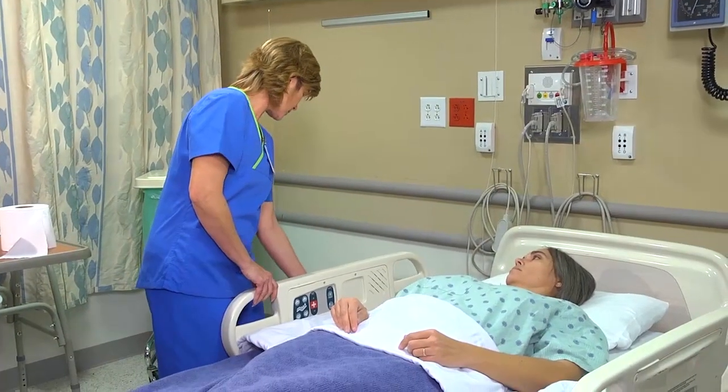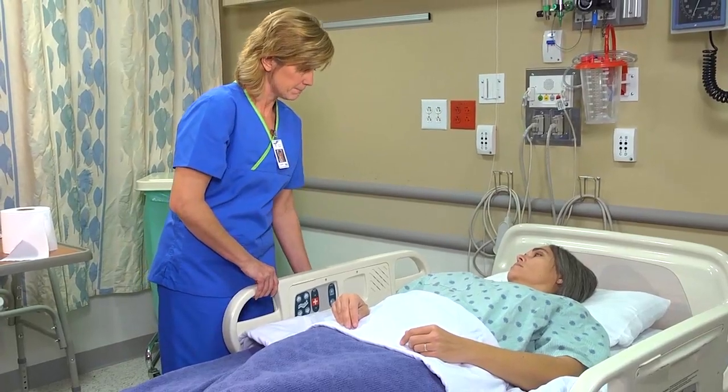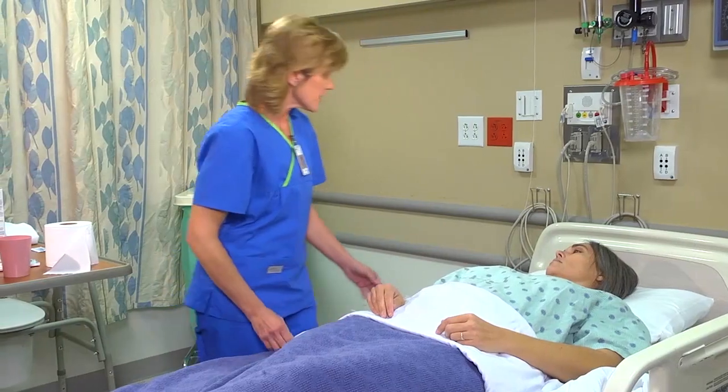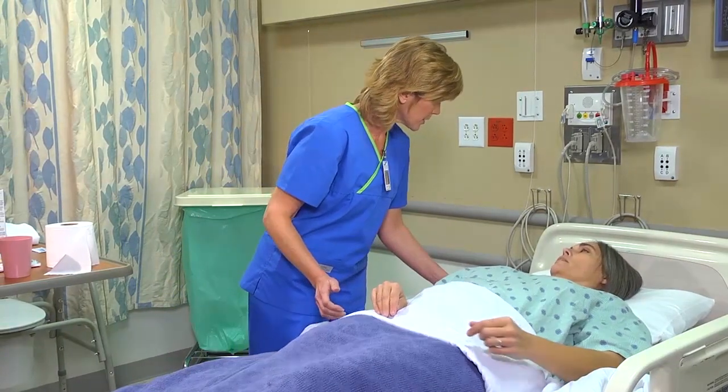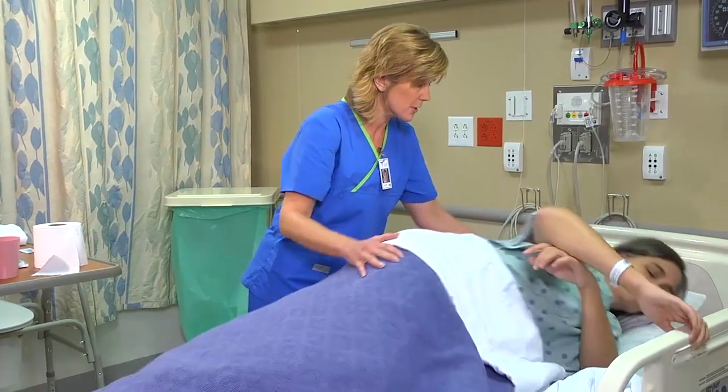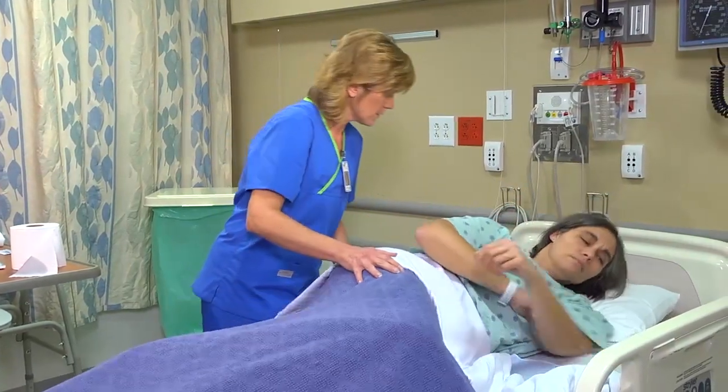Raise the bed to a comfortable working height. Ensure that the side rail on her left side is raised. Then I'd like to assist you on your left side, please, okay? Help her into the left side lying or Sims position with her right knee flexed.